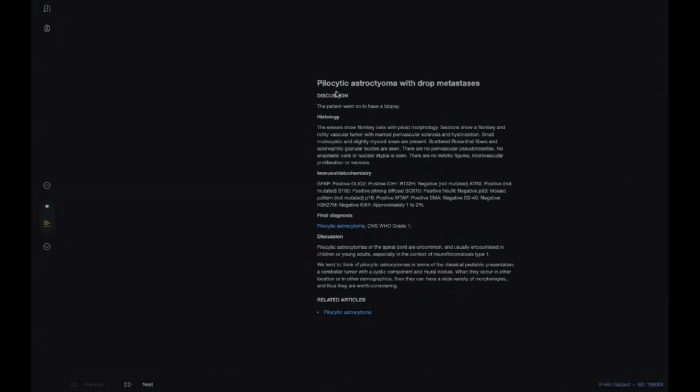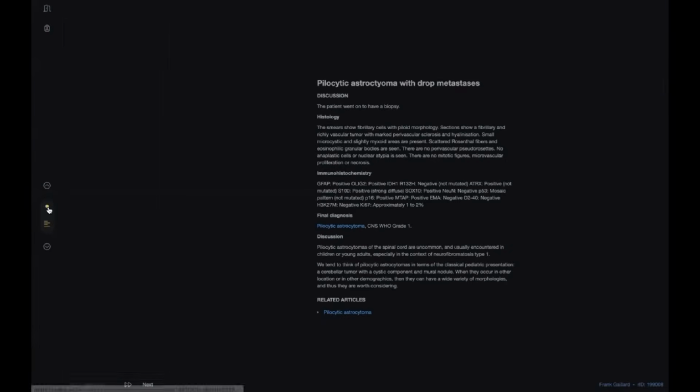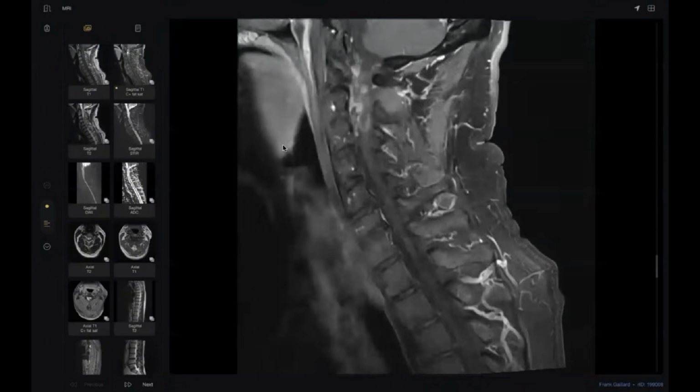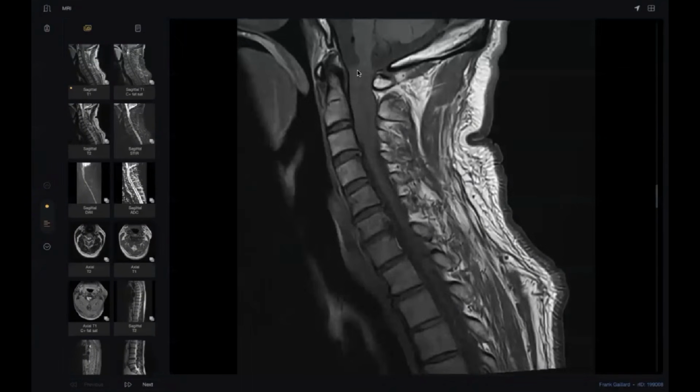Although the patient is an adult, and the most common tumor in adults in the spinal cord is ependymoma, like you said, you are right by the way, pathologically it was proven as pilocytic astrocytoma. Okay, the tricky point here, my colleague. Thank you, Dr. Nagam, so much. You did very well. Welcome. The tricky point here is very obvious, very easy to pick up here.